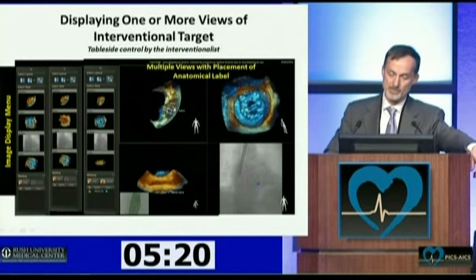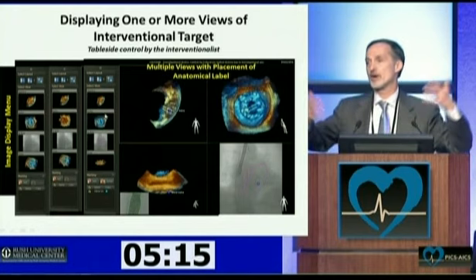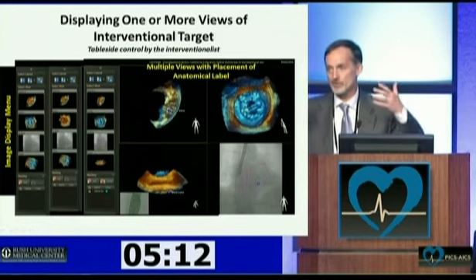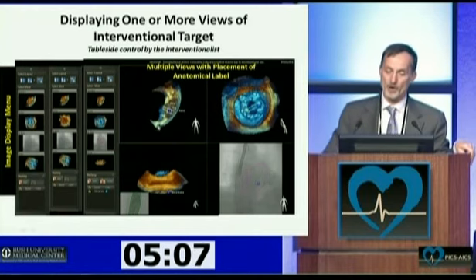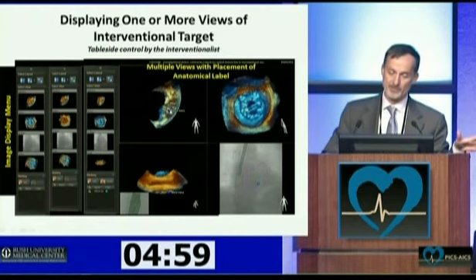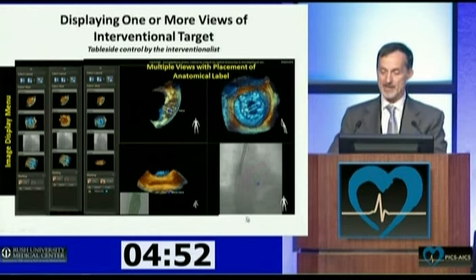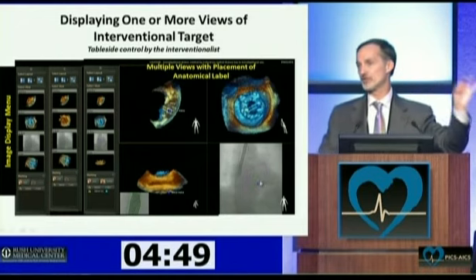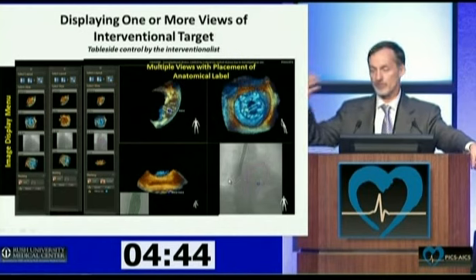And so we get both of these, and we get side views, which diagnostically an echocardiographer would never really present to you, because it's really a view that's determined by wanting to get a side view of where you're going to cross. Very unique. And where you place a particular mark will now show up on fluoroscopy because the two are registered. So you make fluoroscopy have the key landmark soft tissue target that you want. So it becomes smart fluoroscopy.